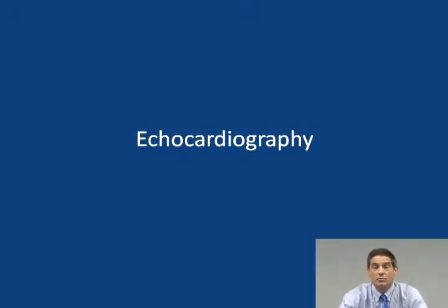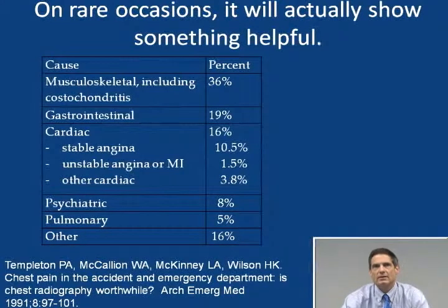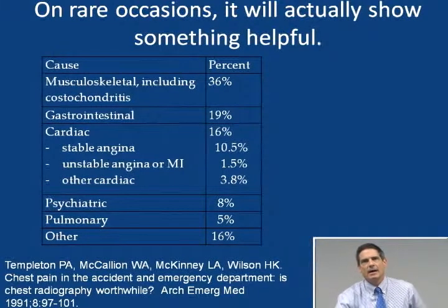So, those are sort of your general tests available. So the next point is that everyone with chest pain who needs imaging basically gets an X-ray. Sometimes it's the only study you need. Now, how worthwhile is it getting the chest X-ray? Well, actually, frankly, a lot of times it doesn't really show you too much. Imaging of chest pain always starts with a plain film, but it doesn't often really reveal anything helpful or diagnostic.